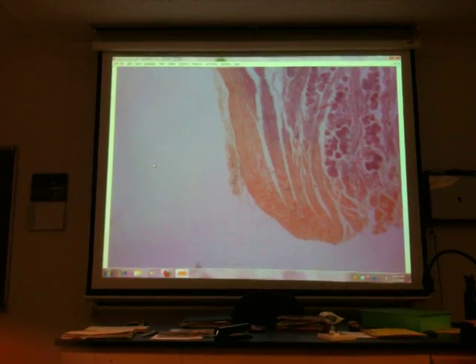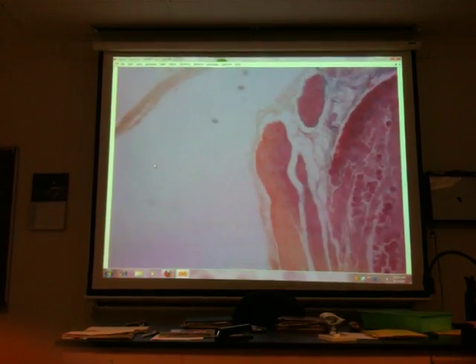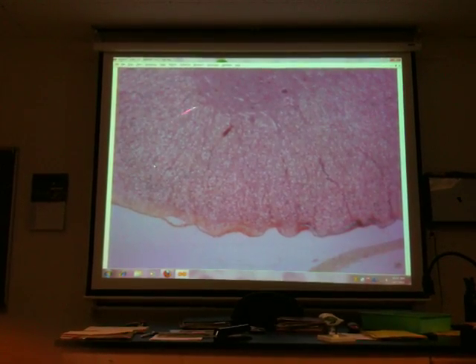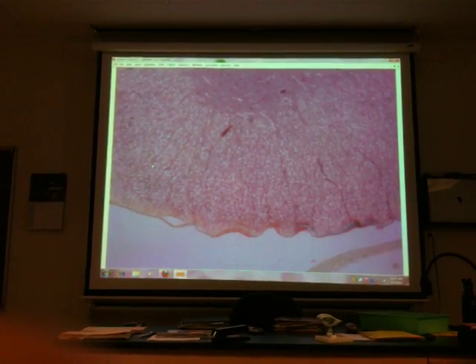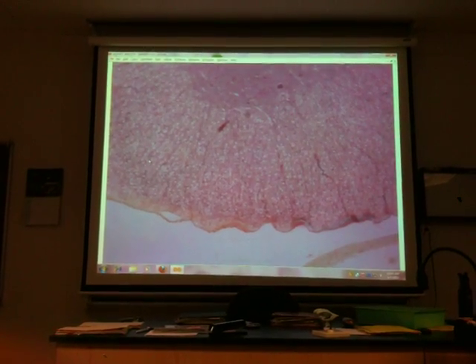And if we try to follow this over to the cord, you see it got disrupted. So I don't think I have a slide that shows you the ventral or anterior root coming off that anterior cord. So I typically don't ask that one on this test. Okay? So that is the spinal cord slide.